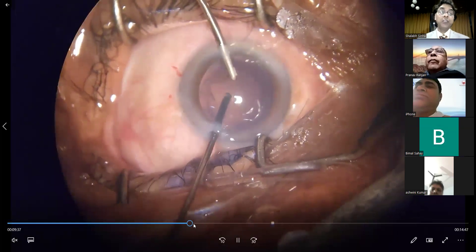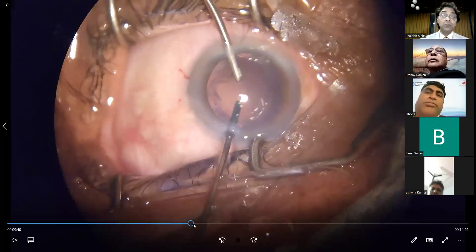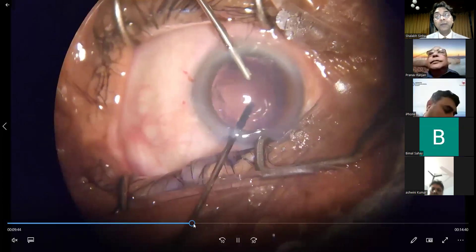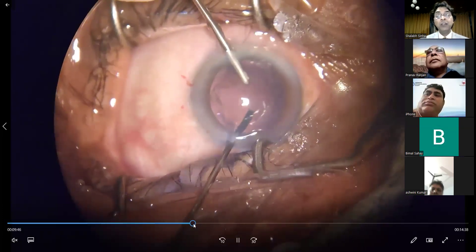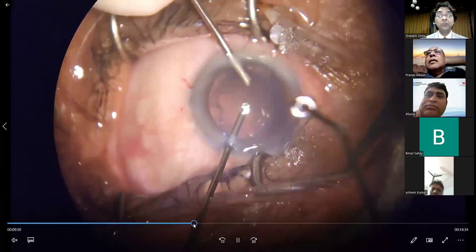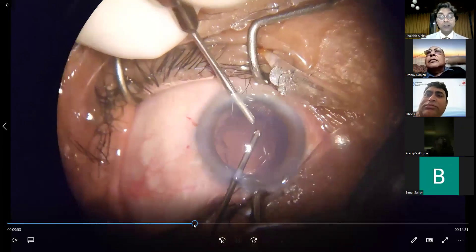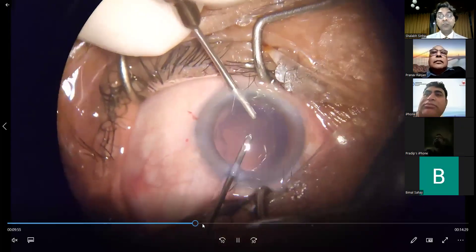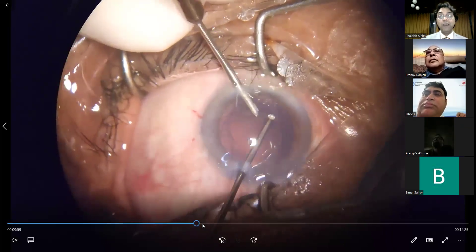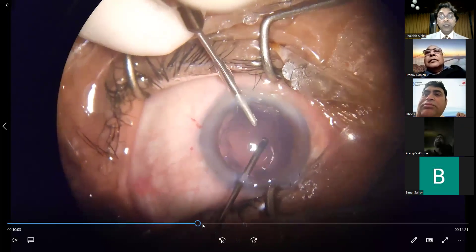We have also been told that you can use triamcinolone to stain the vitreous at this point, or even after you feel you've done a good vitrectomy and wish to check whether there is any residual vitreous in the anterior chamber — you can use triamcinolone for that purpose.